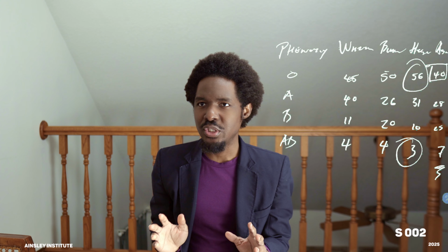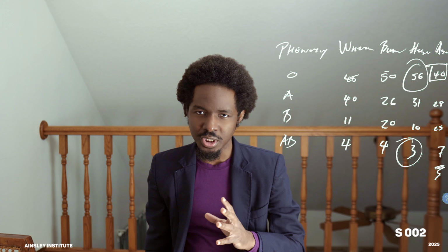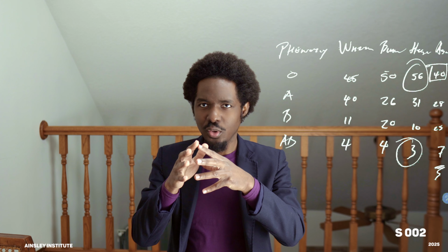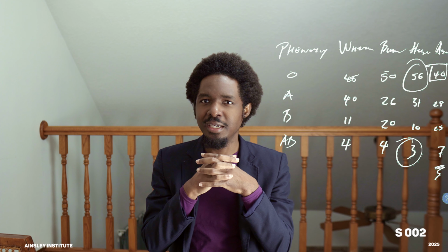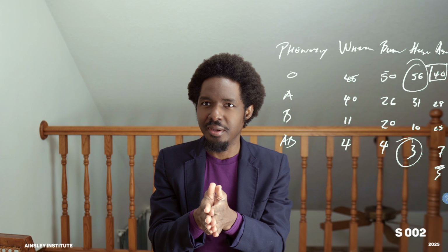We could go into the offspring determination for the ABO, but we're going to leave that for a little later, and understand that when a person has A blood group, they have a particular marker, right?